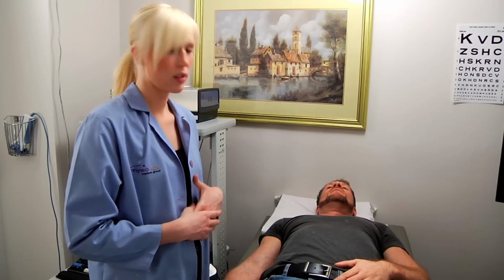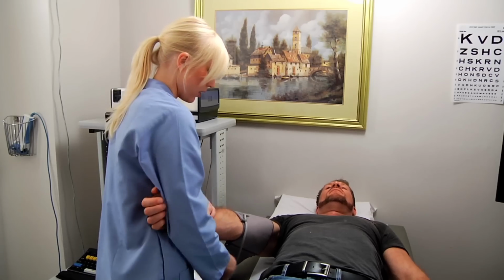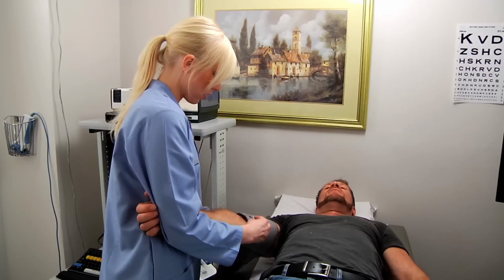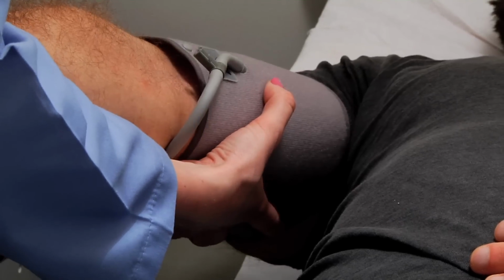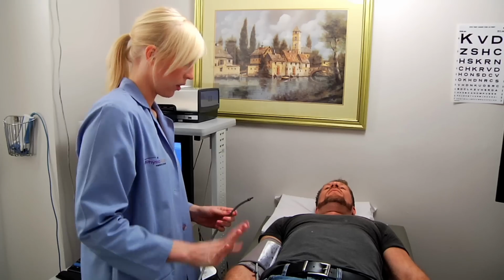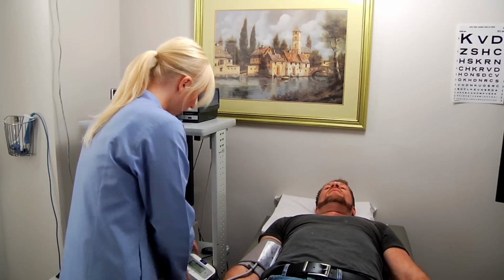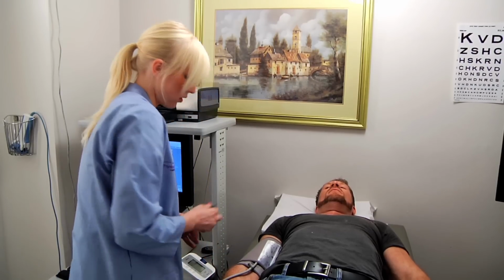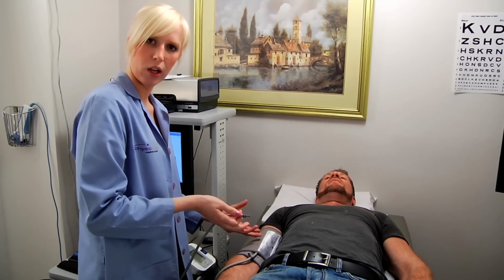So the first thing I do is I put the blood pressure cuff on them. You don't take the blood pressure yet, right away. Make sure the arrow of the blood pressure cuff is lined up with the center of your elbow. Get it nice and tight there. Velcro it down, and I set their arm down. Plug this in. I also find it helpful when you're putting the blood pressure cuff on to remove this from the machine because you can move the cuff around a little bit easier.